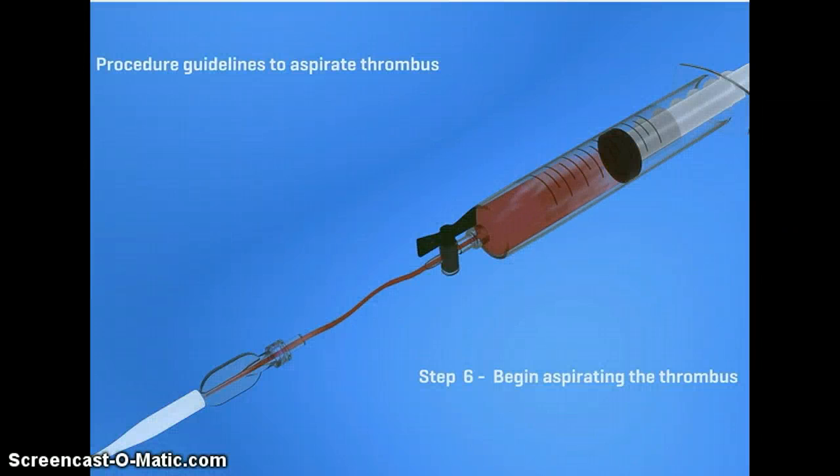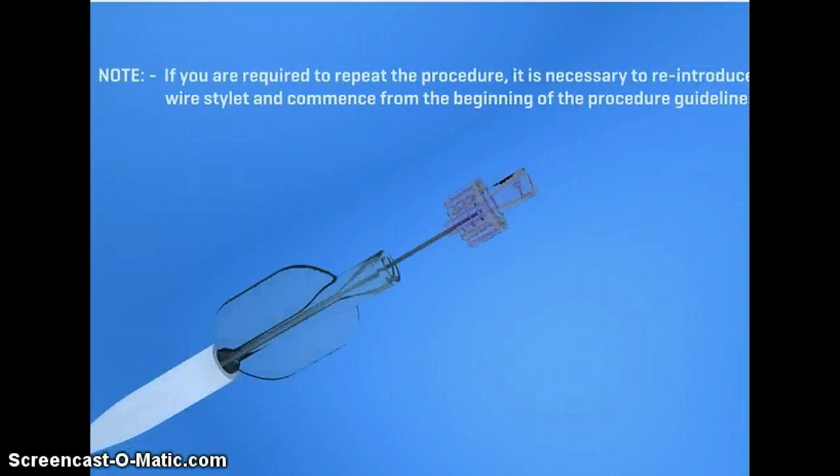This video is just demonstrating pulling back on a catheter to aspirate the thrombus. That's just your simple aspiration catheter.